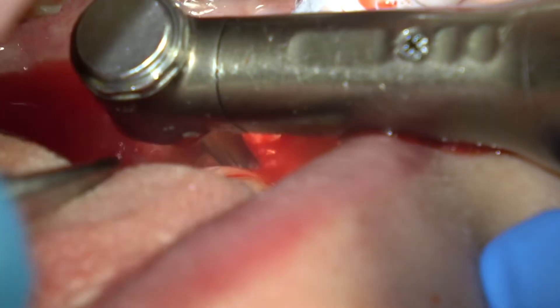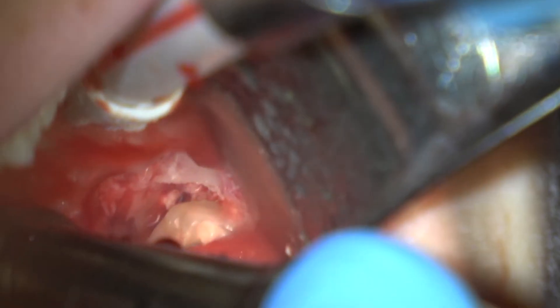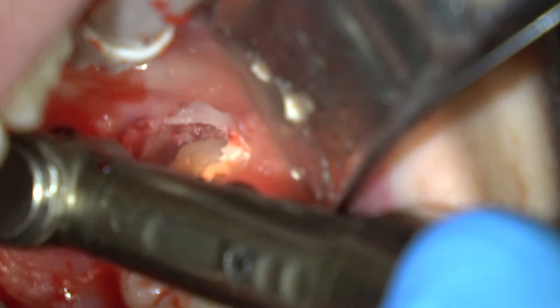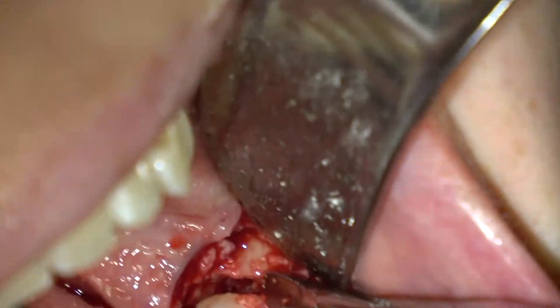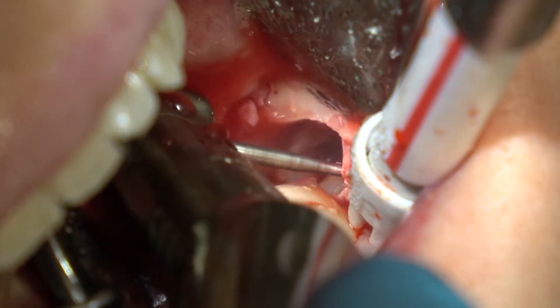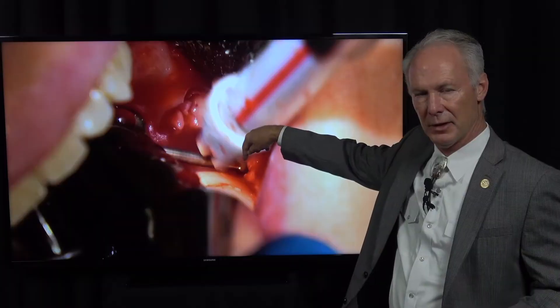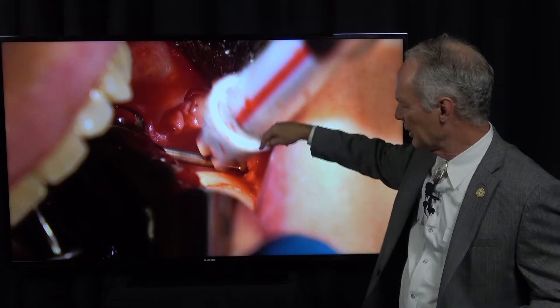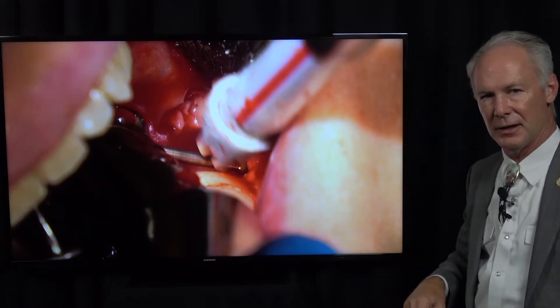I'm cutting through the tooth just like I showed you on the radiograph with this long shank surgical burr, and you want to cut through to the furcation. I've already looked at the radiograph so I know the precise angle I want to cut, and I'm separating the tooth into two pieces. I placed the elevator between the two pieces and elevated that piece out. Now I'm making a little cut in the third molar tooth on the mesial — not the bone — to create a little space between that piece and the distal of the second molar. Cut the tooth, don't cut the bone.